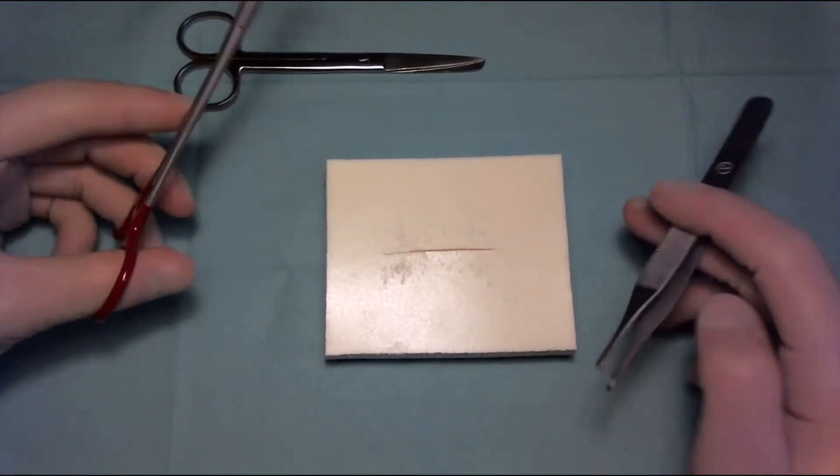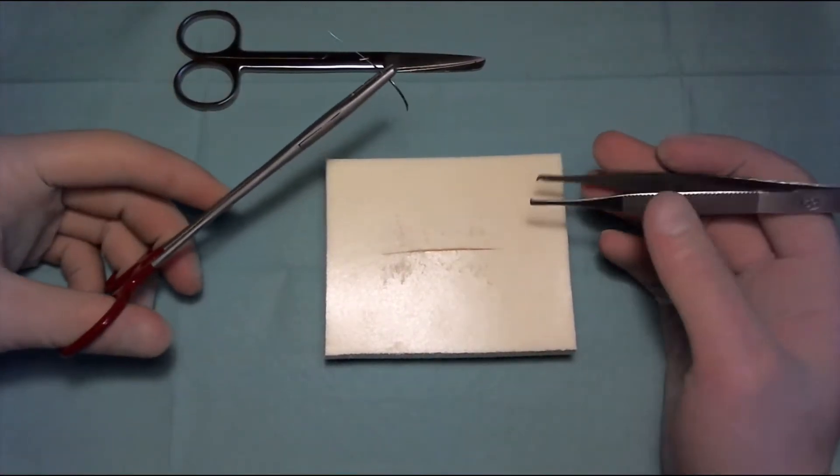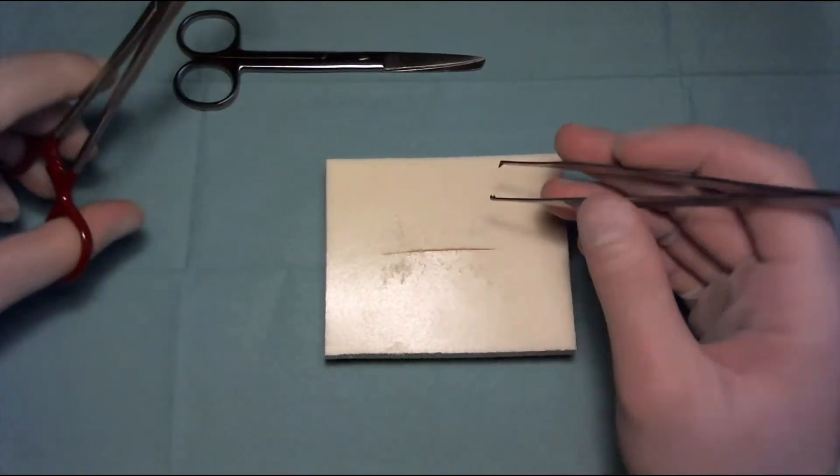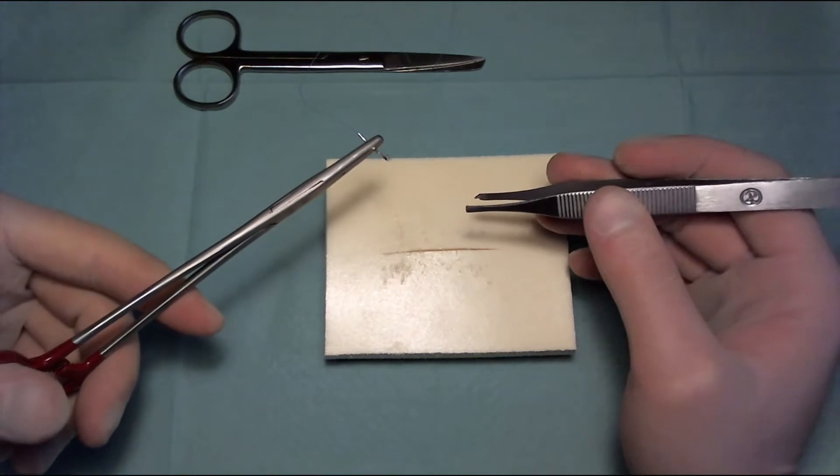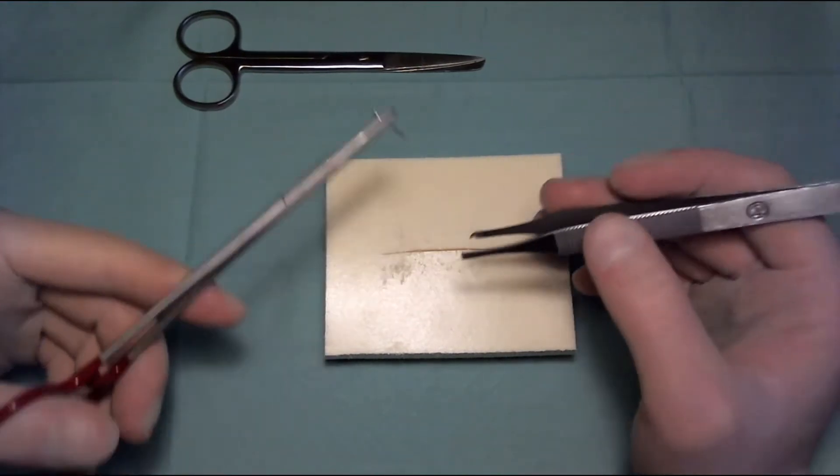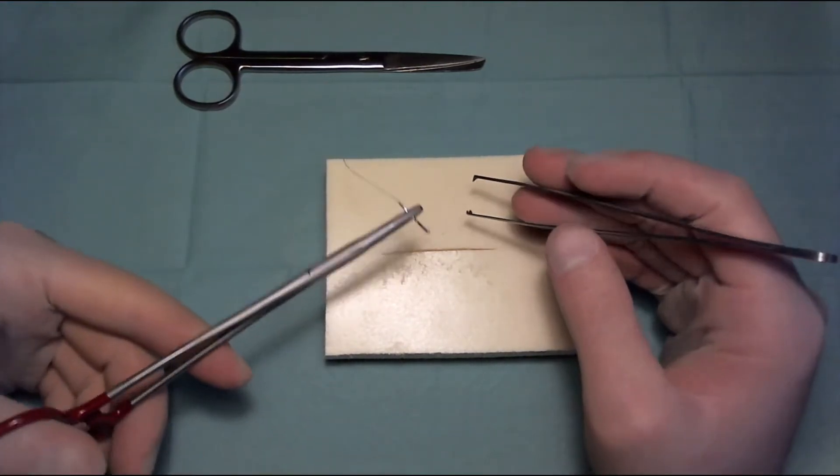We're going to look at how to do a Denabi suture, which is also called a vertical mattress suture. We're going to start with the same equipment and position as with all other sutures, as you can see in the simple interrupted video.